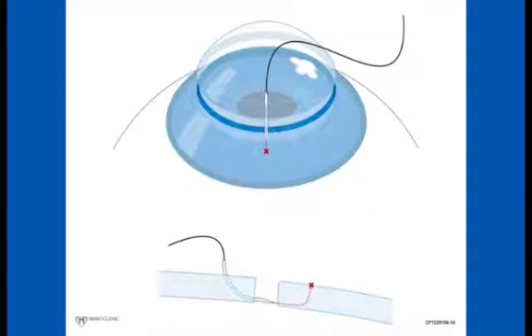But once they acquire that skill, all they have to do is gradually walk the needle down the host wound margin until one is just superior to the deepest position of the host edge. We identify depth with two visual cues. The first cue is the same cue we used with the forcep tip on the deep graft margin. Namely, we look through the cornea watching the resolution of the view of the needle blur until one knows one is deep.